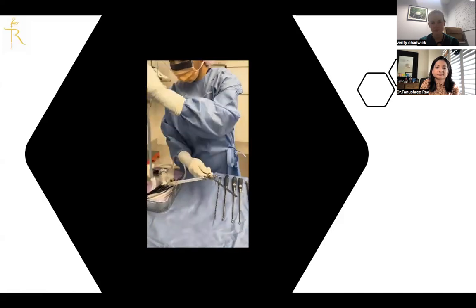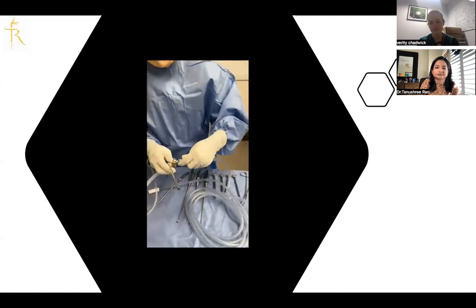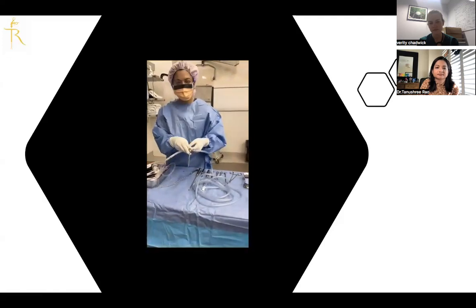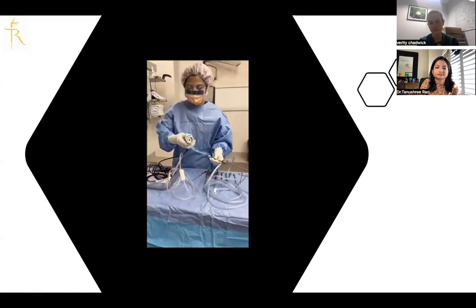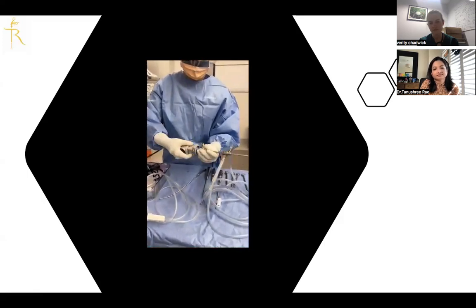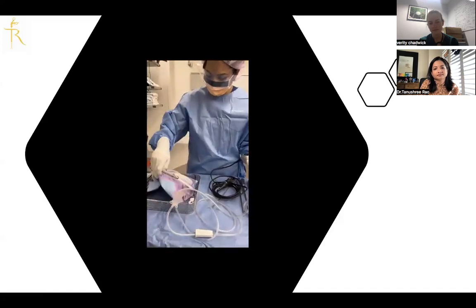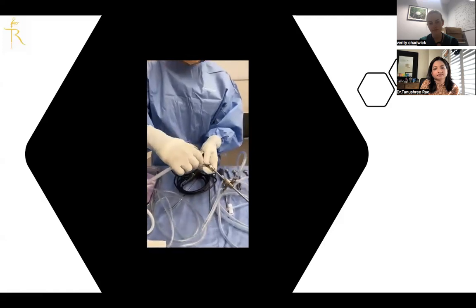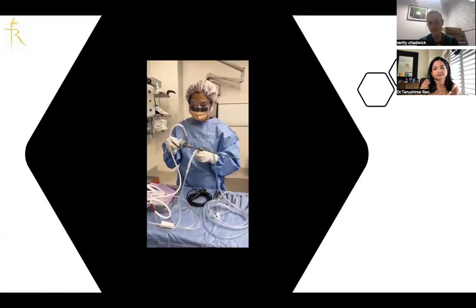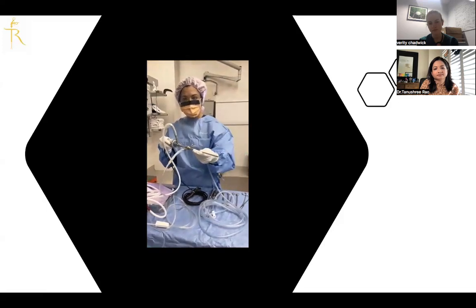And then you have a marking for the outflow channel over here, which goes out. So this is your outflow tube that then gets connected to the suction canister outside. So the entire setup of the hysteroscope should just look like this. The last thing is your actual camera. So that goes and gets connected over here. So you just click it this way and then connect it, and then that's done. Then you can turn it around. And then of course, for any procedure, you will need light. So this is our light source. So this goes and then gets connected to this groove over here. So this is the final setup of the hysteroscope. Light lead, the camera system over here, the inflow channel, the outflow channel, and the actual hysteroscope, and it's all set up. Thank you.